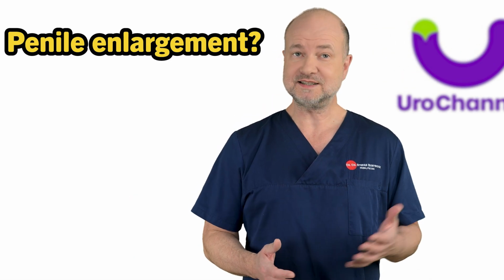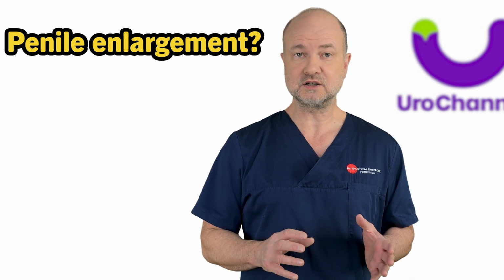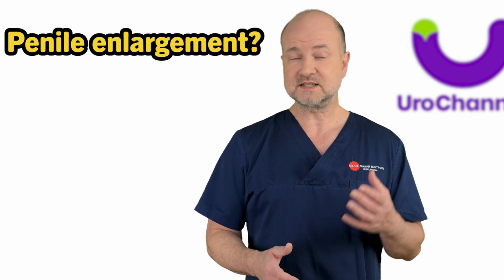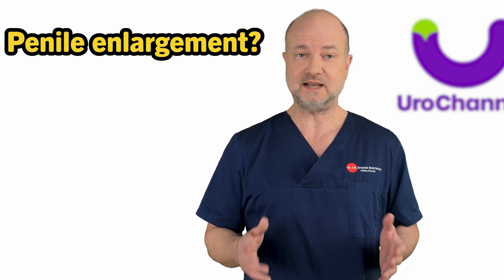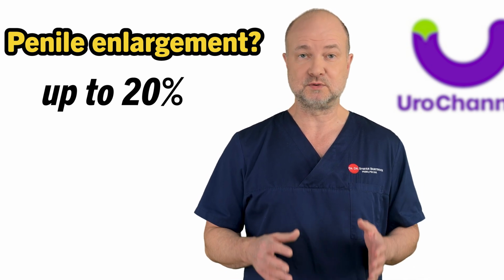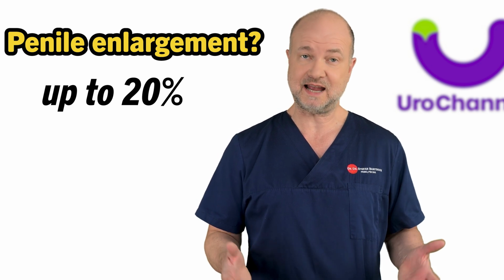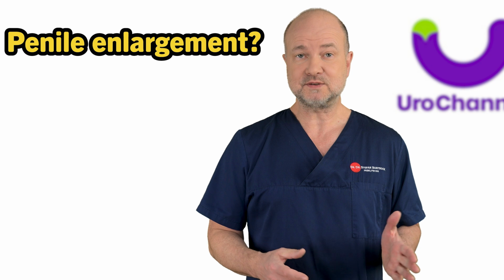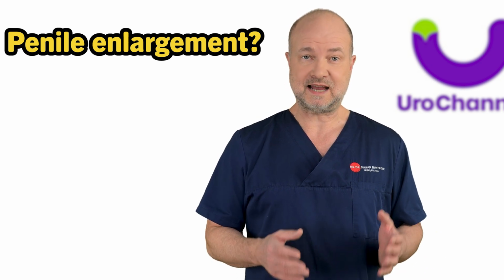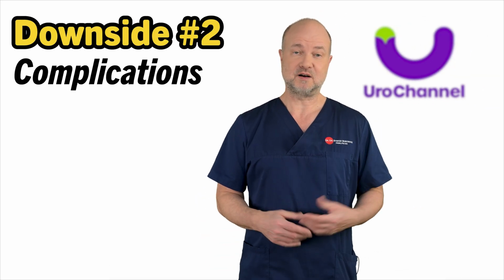So, can an implant make the penis larger? Within limitations, this is possible, yes. During the procedure, the surgeon can carefully place the largest possible prosthesis the individual penis can safely accommodate. There are special prostheses like the Boston Scientific AMS 700 LGX that offers an increase in girth and length of up to 20%. Naturally, depending on the individual anatomical circumstances and possibilities. But even after prosthesis placement, there are reports in the literature where plastic surgery has been able to increase visible penile length.